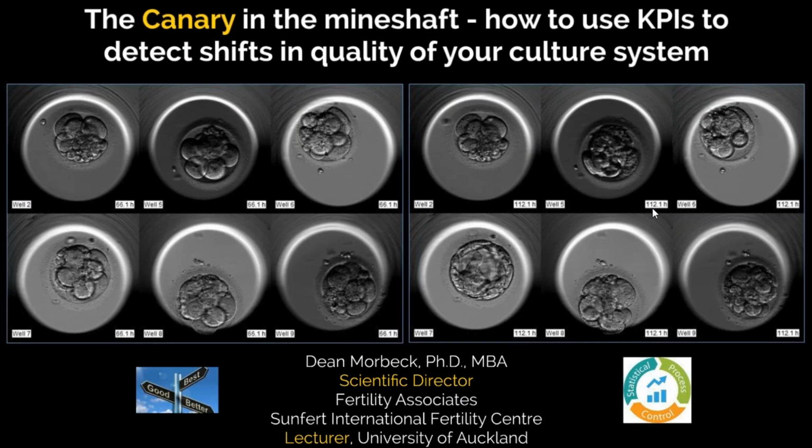What is the formula to calculate a good embryo rate? Well, it depends on what your definition of a good embryo is. That's the first thing, and we all have different definitions. I mean, there is the Alpha consensus on that as well. I think from Istanbul maybe, it's at least 6 cells and minimal fragmentation at cleavage stage. And then for blastocysts, as I said earlier, most were saying a grade B or better divided by the number of 2PNs in culture. And so that would be the good quality utilization or good quality rate.